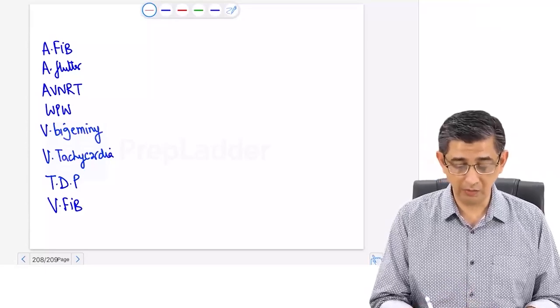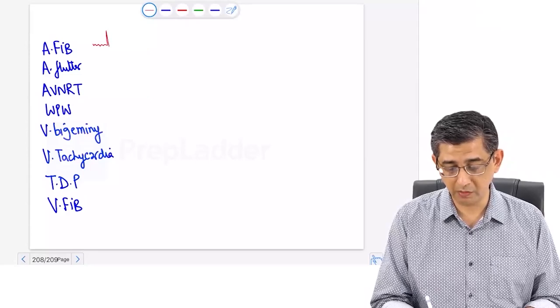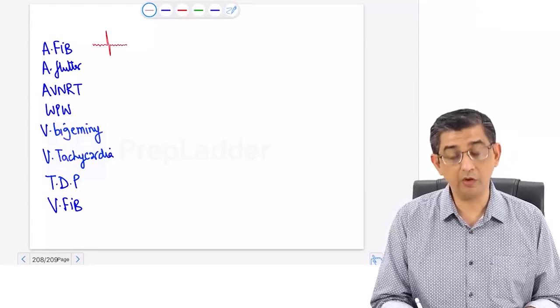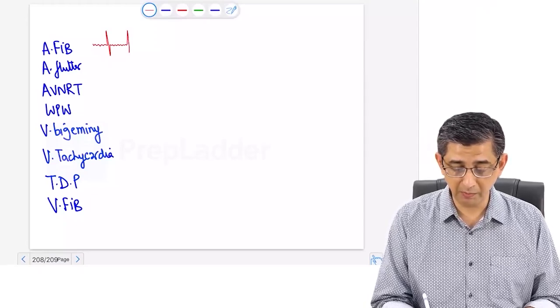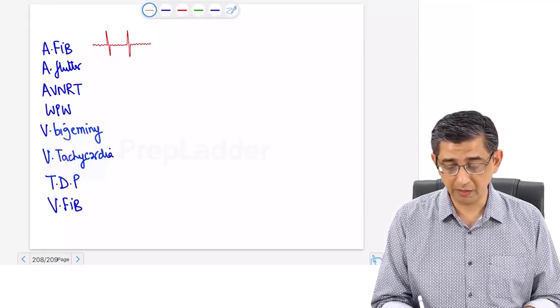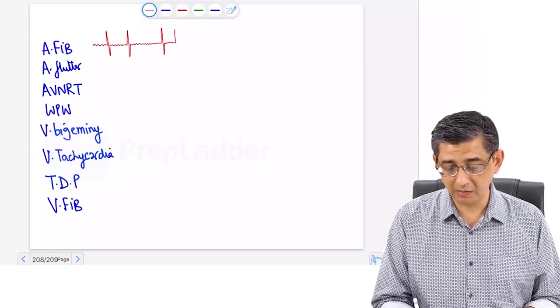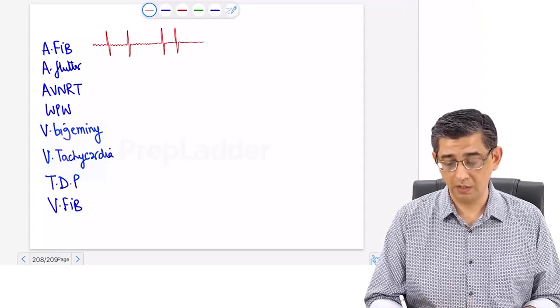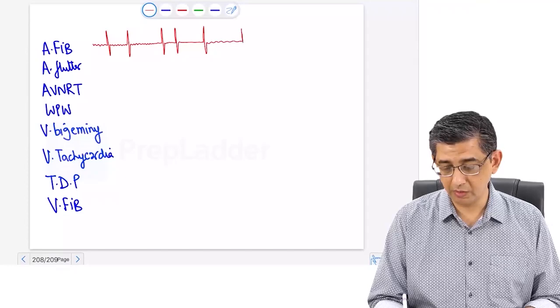But what I want to highlight for atrial fibrillation is that you will notice absence of P waves followed by a QRS complex. In lots of ECGs, even T waves may not be given, or even if they're given, they will be relatively bigger than the twitching that I'm showing. In fact, the highlight of atrial fibrillation, as you can see from the sketches, is that the heart rate can touch normal, and then you can notice the acceleration. The main highlight of what I've sketched before you is the irregular RR interval.